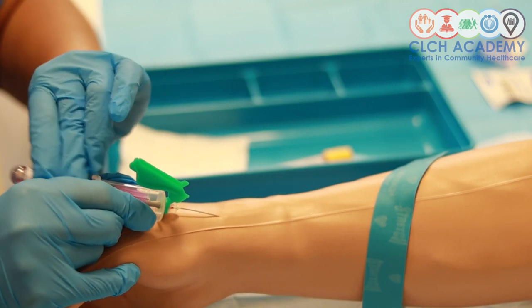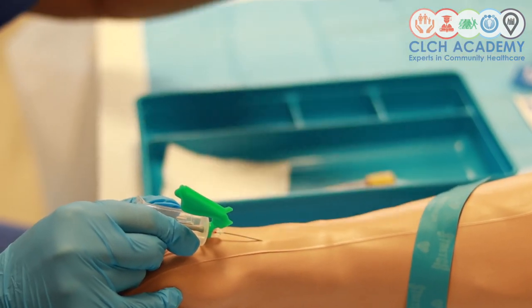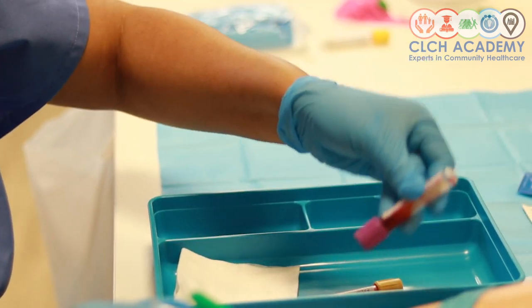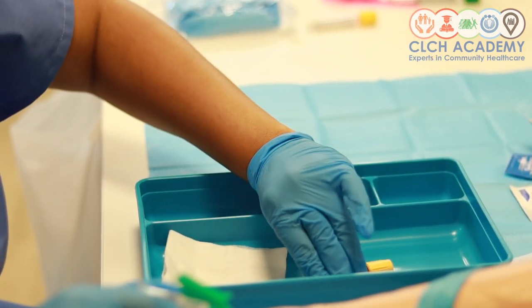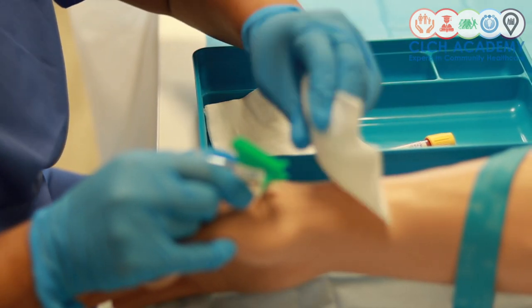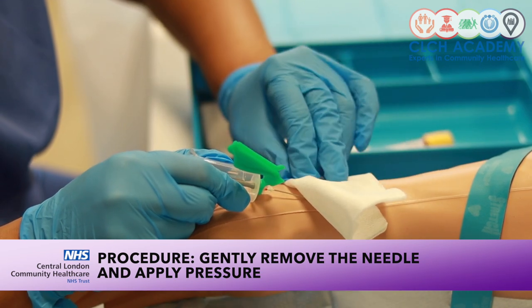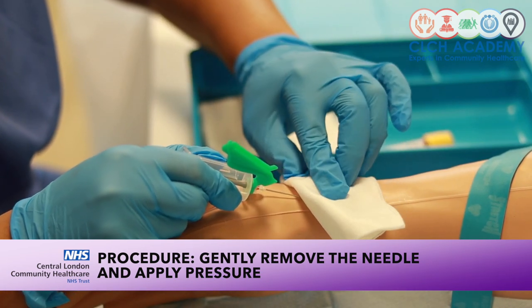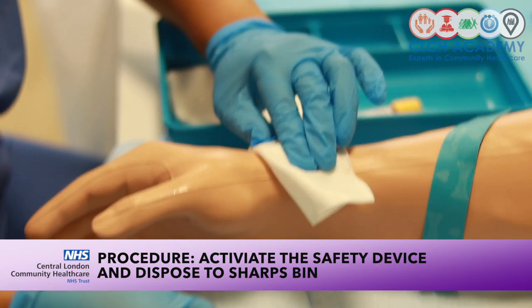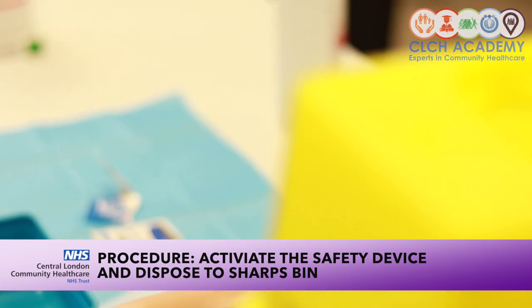Filling that up nicely, doing my inversions up to 10, and 7 and 8 and 9 and 10. That's done. Placing the gauze lightly on top, gently removing the needle and applying pressure, turning my sharps device and activating the safety and disposing of that in the bin.